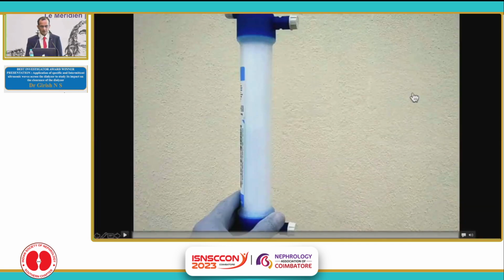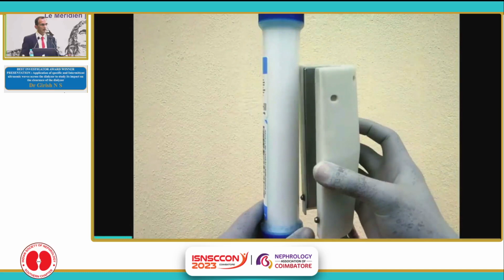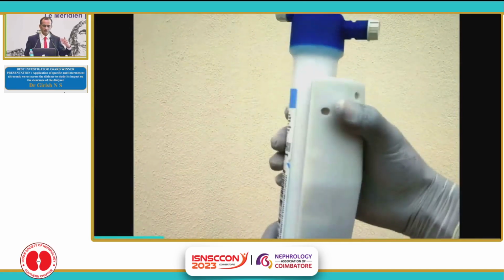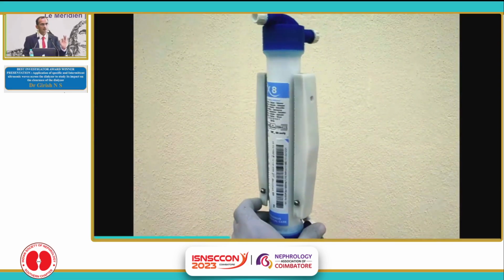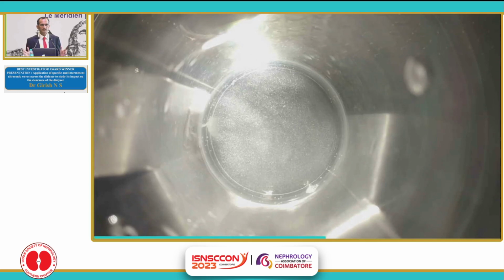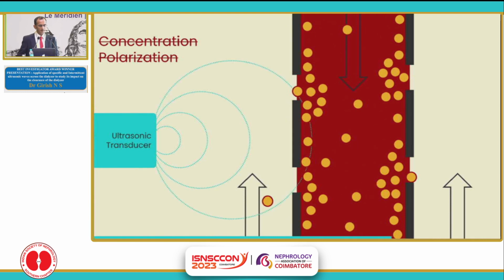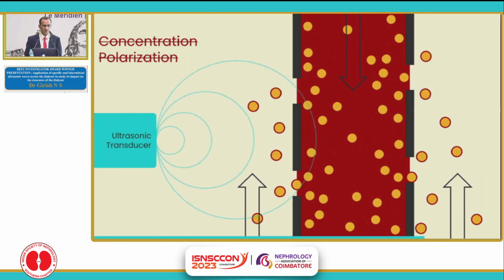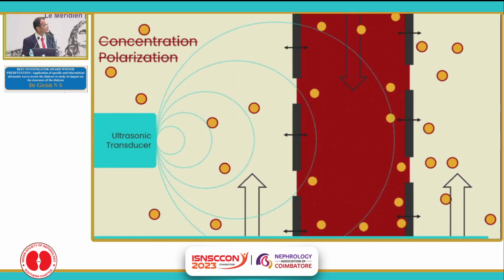I'll show you a small video of how this transducer fits in. It's completely external, and we use a small amount of transducer gel. There is no point of contact with any body fluids or any substance, and it is quite safe because we have this control system placed well away from the patient. The mechanism by which it prevents CP layer formation or dislodges it is something similar to what we hypothesized here.